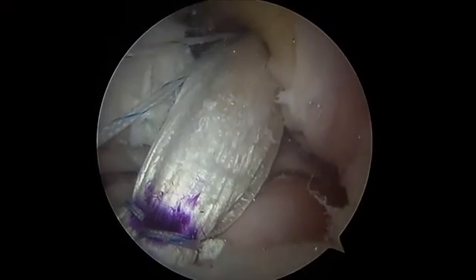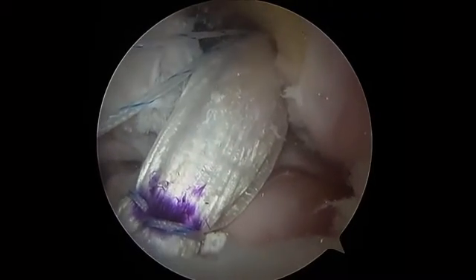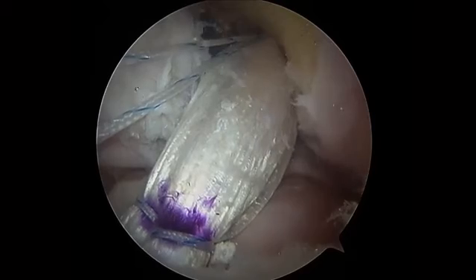So we like this position very much. And that's our ideal philosophy and our ideal position for our femoral tunnel.